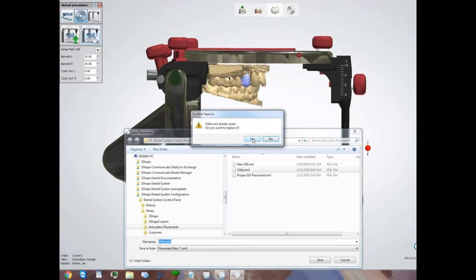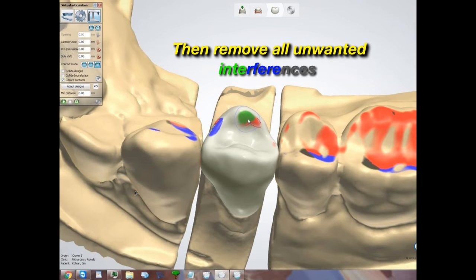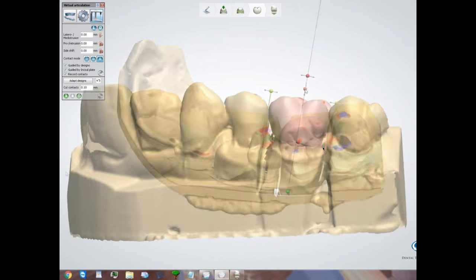When I start looking, suddenly I've got stuff everywhere on my existing teeth — protrusive interferences, balancing interferences, working interferences, broad centric — which is what we want to see. These teeth are sliding all across each other, and it's what the technician is going to see at the bench. Now when we start removing all the interferences — green being balancing, blue being working, gray being protrusive — suddenly your technicians at the bench will go 'perfect.' Because now you're doing it wrong, but you're doing it with tooth guidances. Always check collide designs, because without it checked, we don't see our working, protrusive, or balancing interferences on our crown.